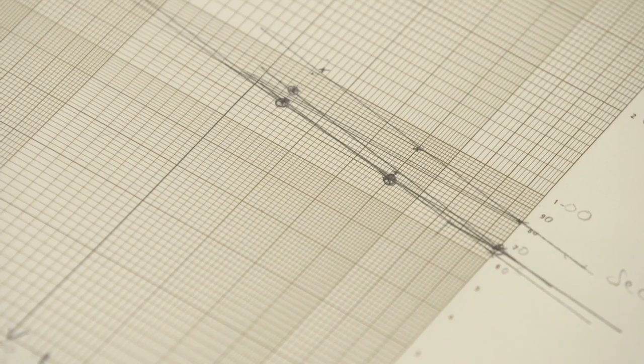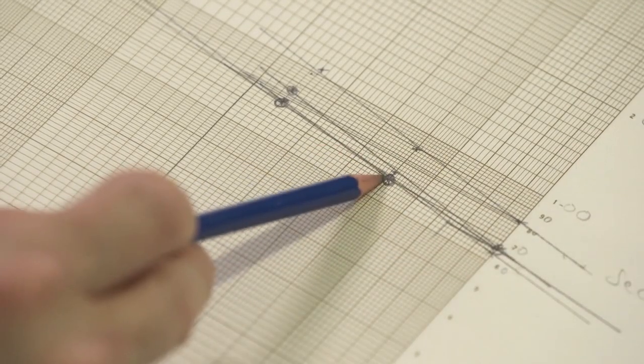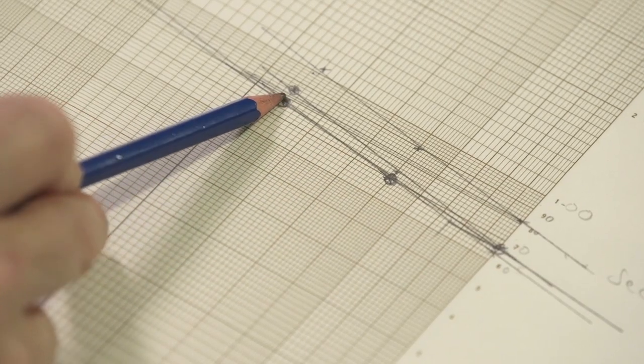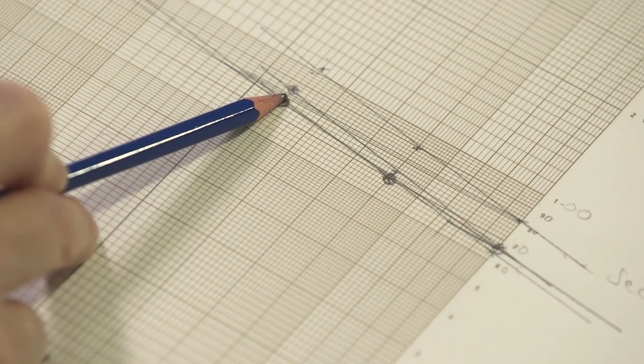And if that occurs, then I think it's safe to use those two dilutions to make an estimate of the factor VIII activity. In this case, we've got false prolongation with the first dilution. But the other two sit almost exactly on a calibration line.